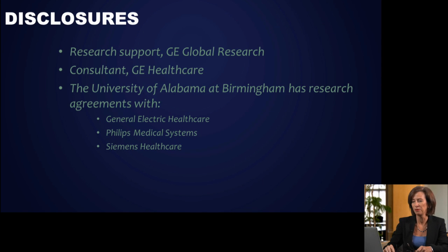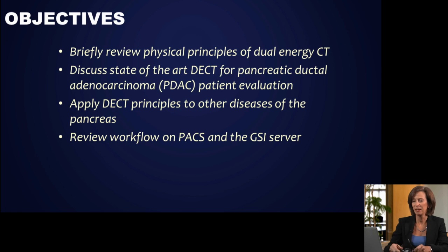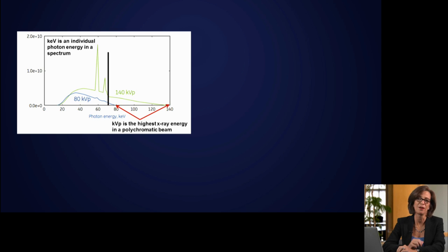These are my disclosures. And the objectives of the next 15 minutes or so are for us to briefly review the physical principles of dual energy CT, to discuss state-of-the-art DECT for pancreatic ductal adenocarcinoma patient evaluation, to apply those principles to other diseases of the pancreas, and finally at the end I'm going to show you some cases and actually go through them using both the GSI server and PACS so you can see how this will work in your practice. So before we get started in earnest looking at images, a little bit of physics review is necessary.